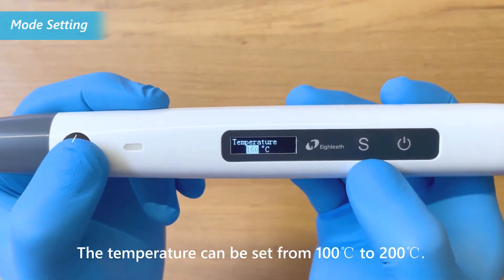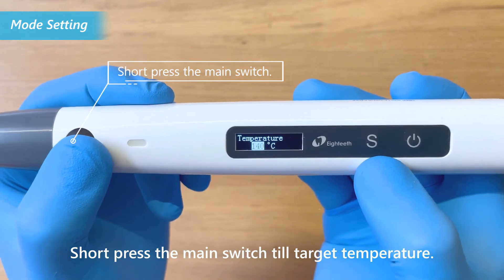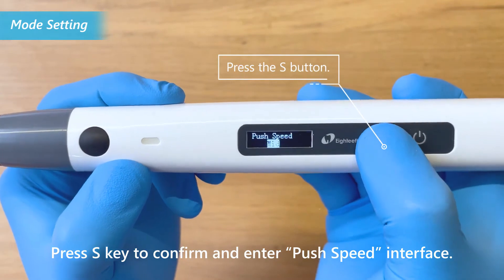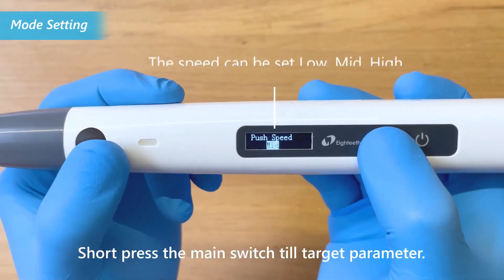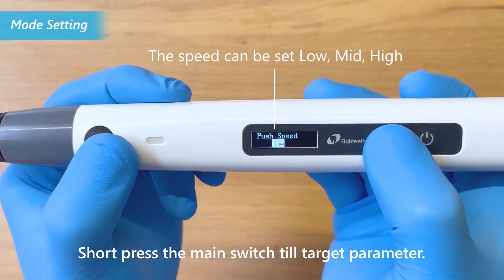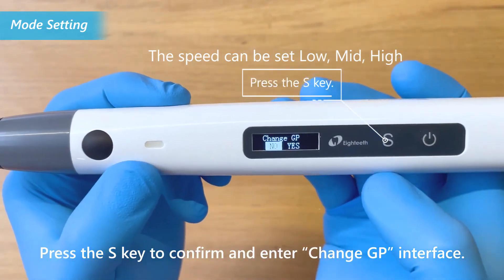The temperature can be set from 100 degrees Celsius to 200 degrees Celsius. Short press the main switch until the target temperature is reached, then press S key to confirm and enter the push speed interface. Short press the main switch until the target parameter is reached, then press the S key to confirm and enter the change GP interface.